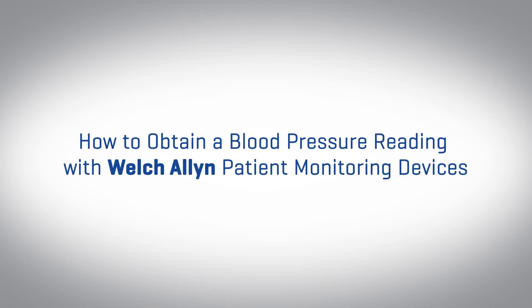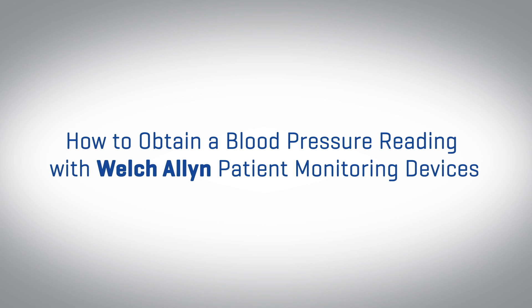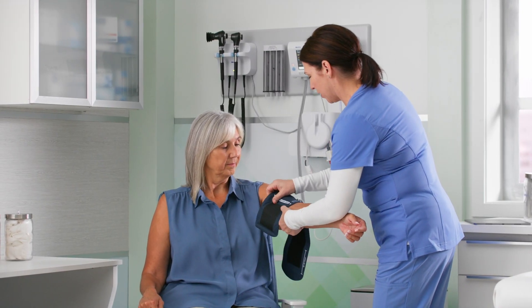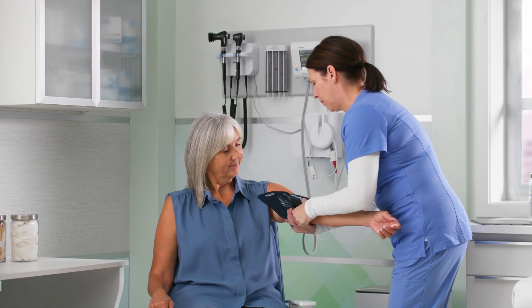Today, we'll review how to use SureBP and the other non-invasive blood pressure parameters of our Welch Allen patient monitoring devices. We'll also incorporate the standard clinical practices of blood pressure measurement techniques to help ensure an accurate reading.